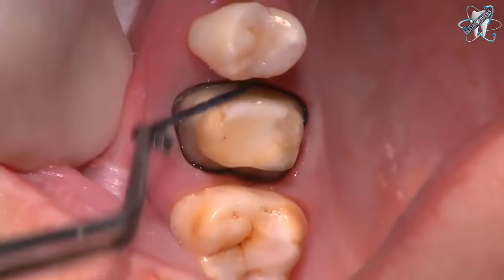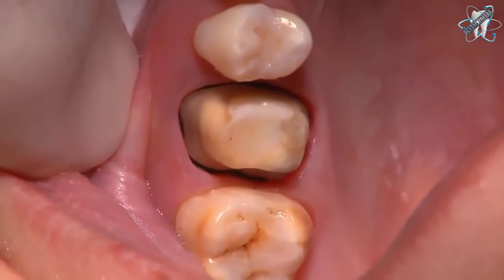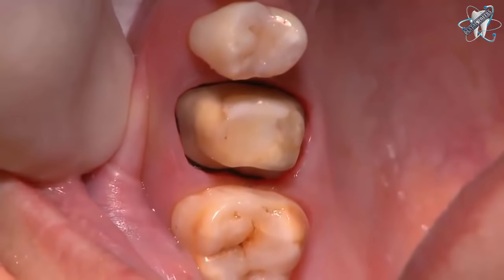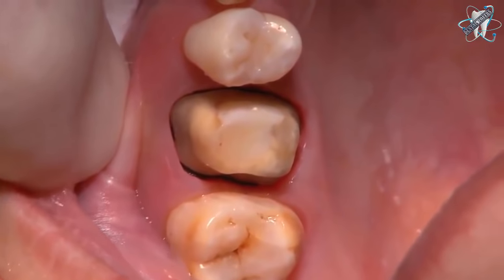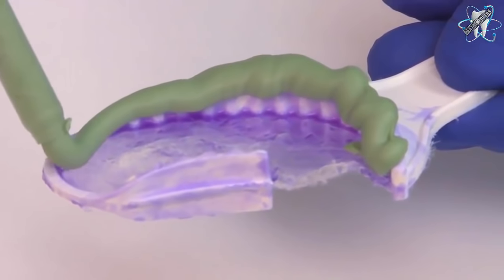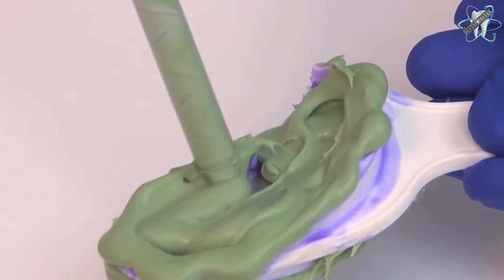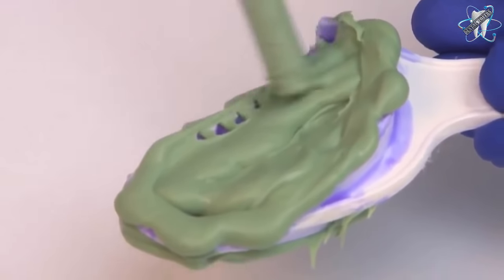The second cord is removed. Retraction cords soaked in B4 help prevent adhesion to fragile gingival tissues that can result in bleeding upon cord removal. Fill the closed bite tray with the AquaSil Ultra Rigid tray material. Unlike other heavy body material, it won't drip off your tray due to its non-slump formula. This allows the rigid material to be stacked high in the tray.